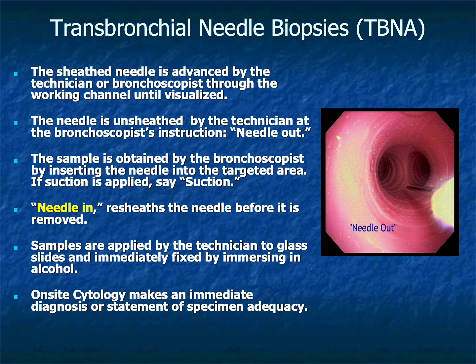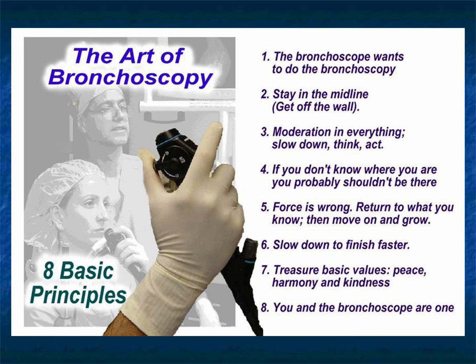These brief procedural commands reflect teamwork. Bronchoscopy rarely occurs as an isolated act. It depends upon the coordination among physicians, assistants, nurses, technicians, and pathology support. Competence extends beyond individual performance. It includes the ability to function within procedural systems. The bronchoscopist usually is the team leader.